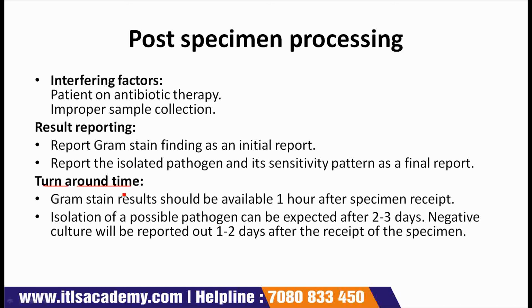Turnaround time. First point is gram stain results should be available 1 hour after specimen receipt.